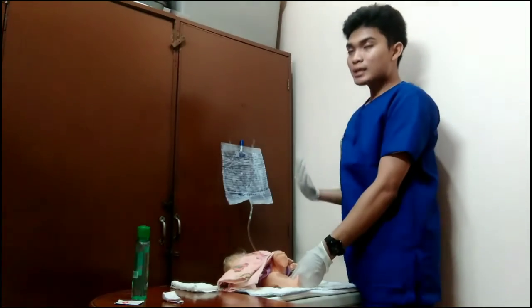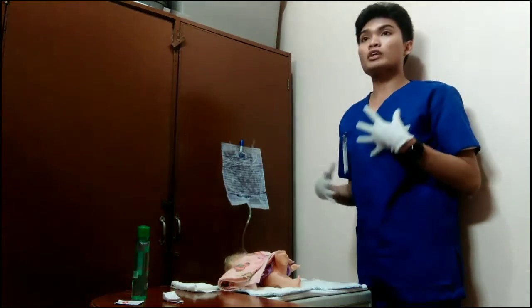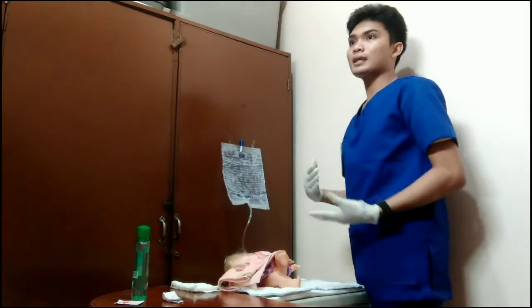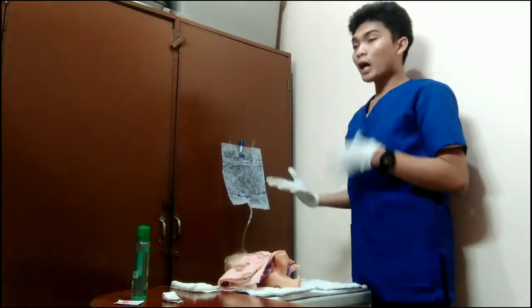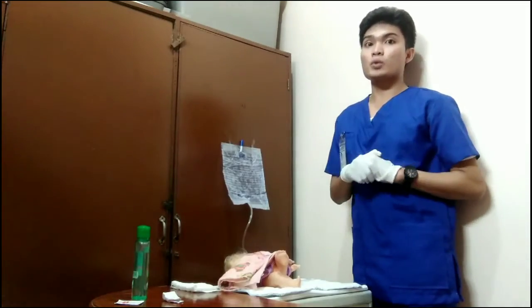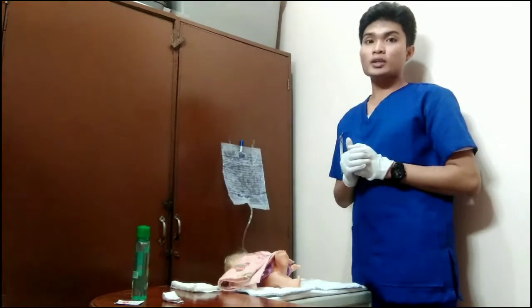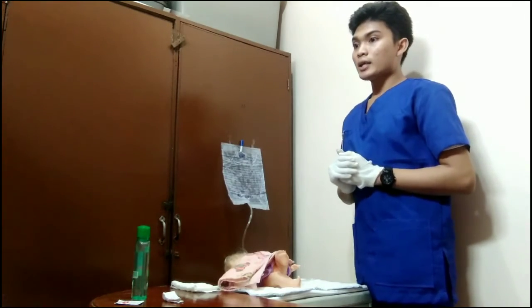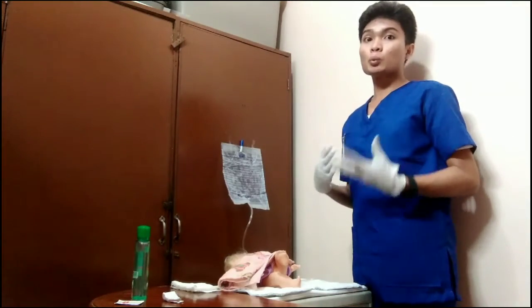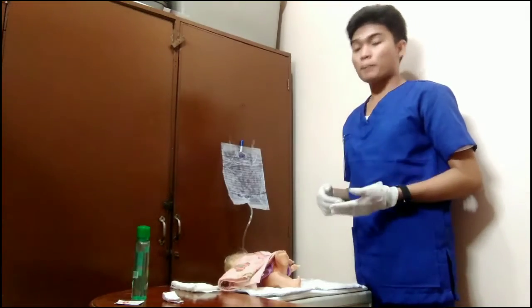If we already checked and removed the stool that might be blocking the tube, and we have asked the client to do breathing exercises, but the resistance continues to persist, we have to stop the procedure and report it to the primary healthcare provider and the nurse in charge. We should never force the tube or the solution to enter the anus because it might cause trauma or injury to the patient.